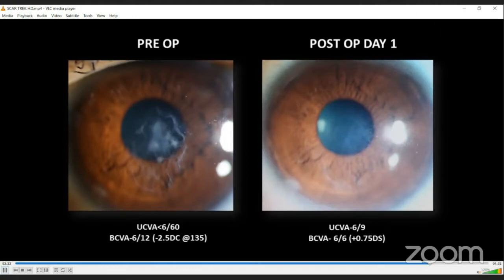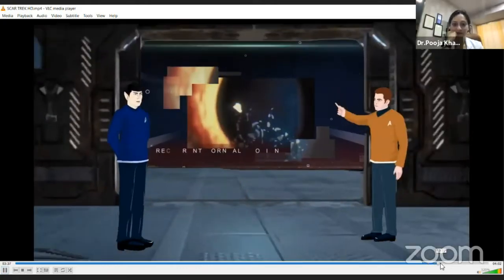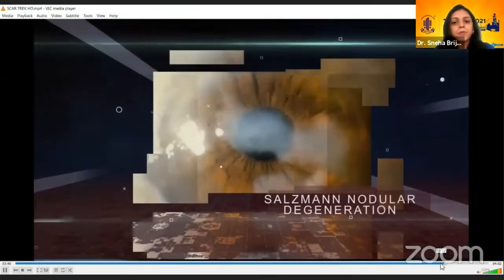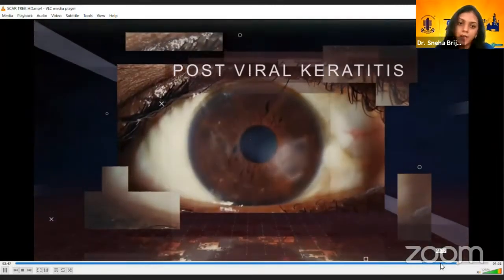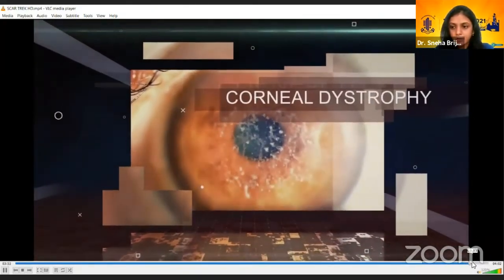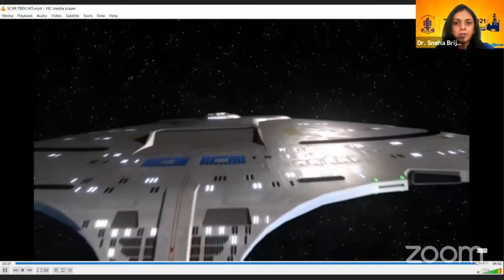Go ahead, finish it. Yeah. So this has opened up a new dimension for customized treatment. It can be treated in the following conditions: post-PRK haze, recurrent corneal erosions, post-viral keratitis, band-shaped keratopathy, and corneal dystrophies, the superficial ones. Thank you.